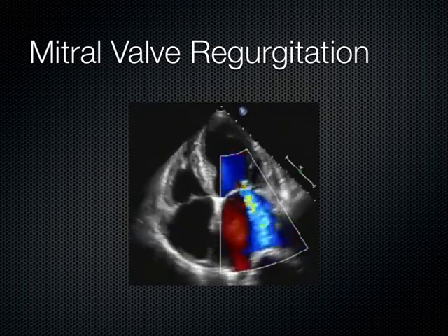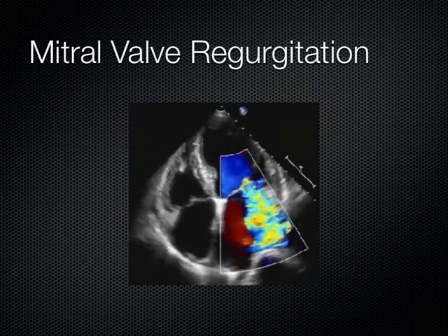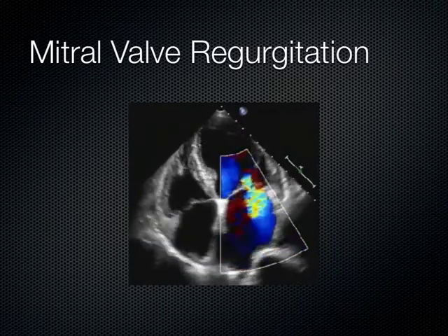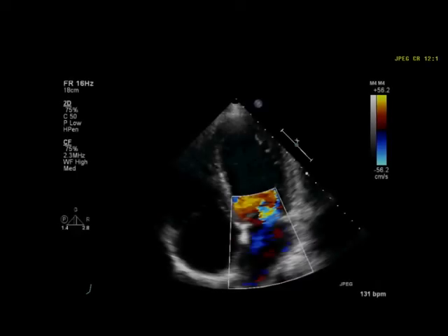And we do this in the apical 4, not the parasternal long, because recall that when you work with Doppler, you don't want the Doppler to be at a 90-degree angle with the angle of insonation. And in the parasternal long axis, when you look at the mitral valve, you're at about 90 degrees, whereas in the apical 4 chamber view, you're closer to more parallel. The sound is more parallel with the flow of the blood, and you're closer to an angle of maybe 60 degrees or even less, even 45 degrees. So that's the idea. The more parallel you get, the better Doppler works.